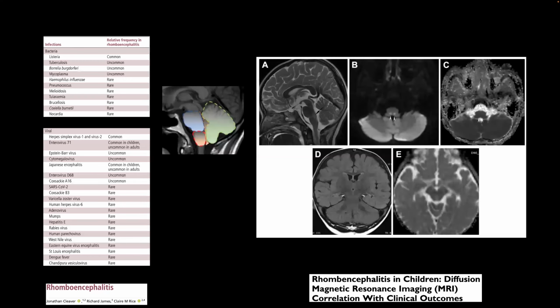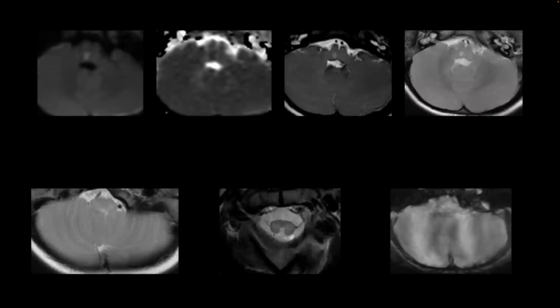I understand your point. So you are saying it doesn't correspond with this focus over here. If you say it corresponds, but over here the medulla is again brighter, meaning the cord could be artifactual, but there is some degree of edema. So if we put that aside, what about this infarct? I would say it's an infarct, just a small infarct.